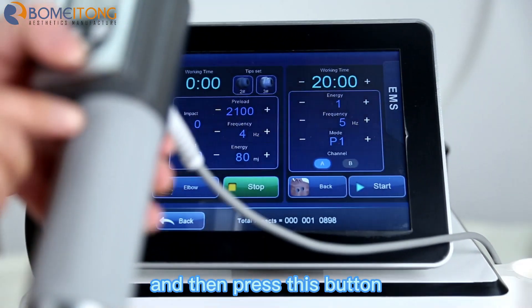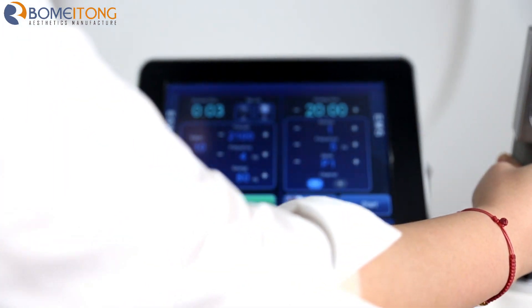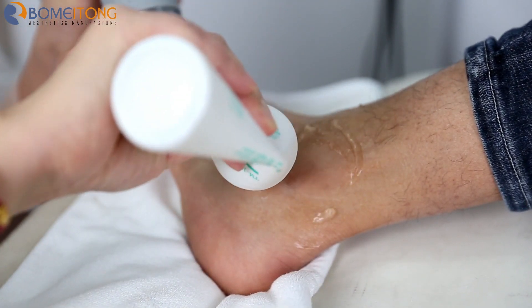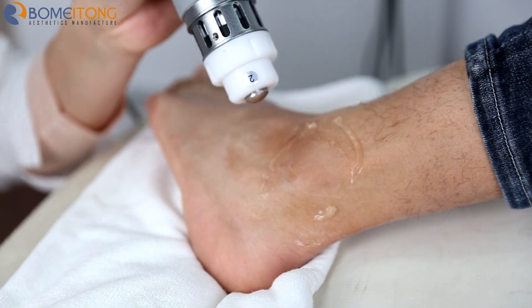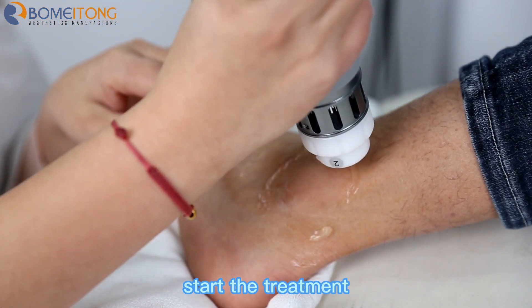Then press this button. We put some cooling gel first around the ankle. For the ankle treatment we use the two working hand. Then click start and click this button to start the treatment.